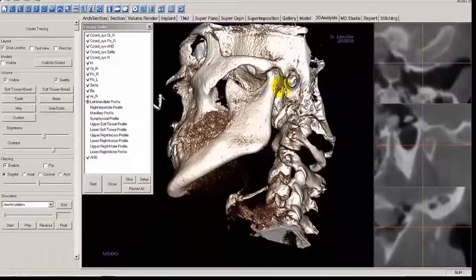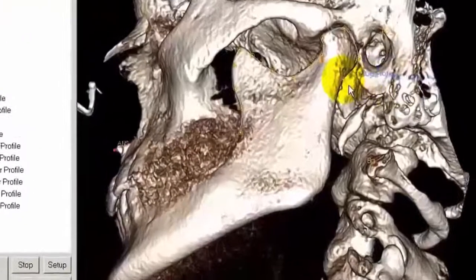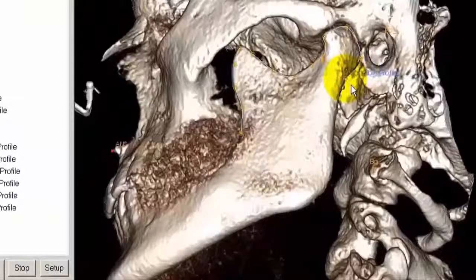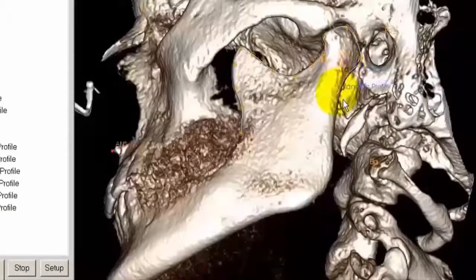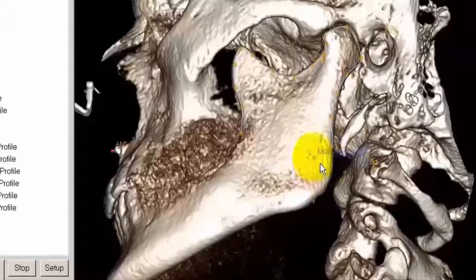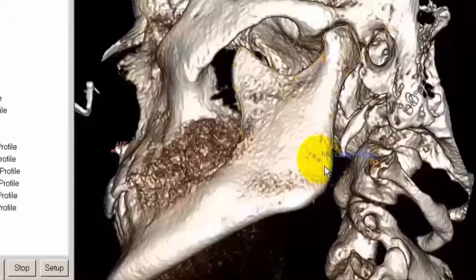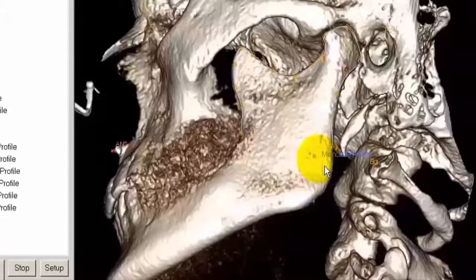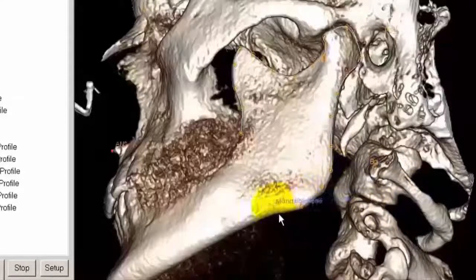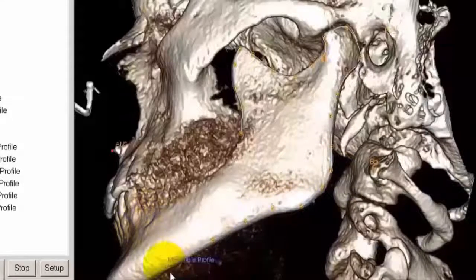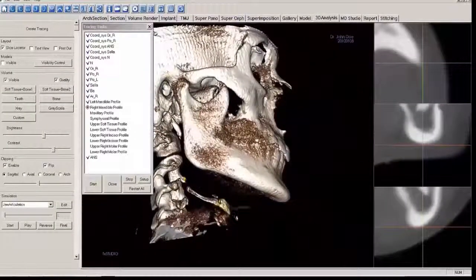That looks pretty good. Now just follow the ramus down, ending right below the mental foramen. Left-mouse click as you follow along the ramus. If you place a point somewhere you don't want, press Escape on the keyboard to remove that point and go back to the last point added. Continue following the anatomy, then left-mouse click right underneath the mental foramen and right-mouse click to stop.